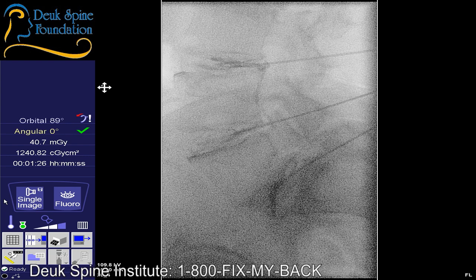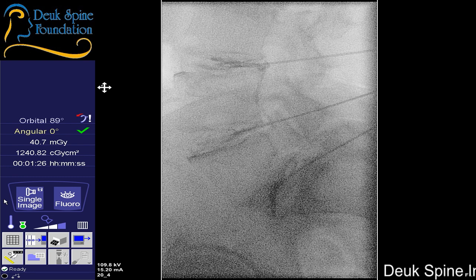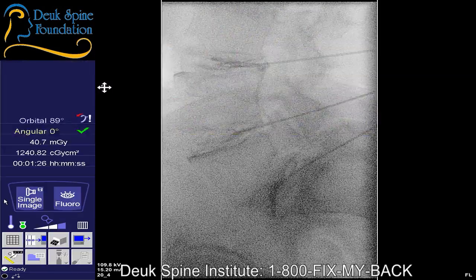Now, I didn't tell you I was injecting, did I? No. So you were blind to the fact that I was injecting, but you certainly had a response. Absolutely. Now, you didn't respond to L5-S1. Why is that? Because it's not causing pain. But you responded to L4-5 and L3-4. Why? Because they're causing pain. Is L5-S1 herniated? It is herniated. L3-4, L4-5, L5-S1 are all herniated, but L5-S1 didn't cause pain on the discogram because it's not causing your daily pain.